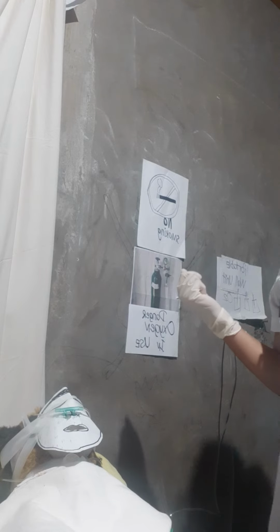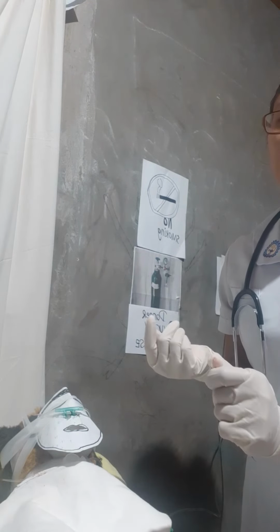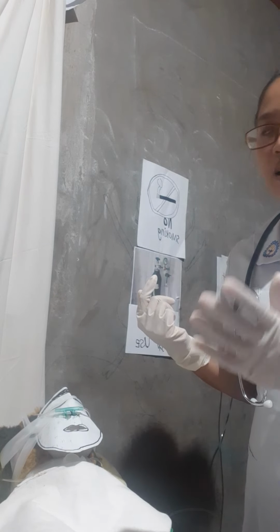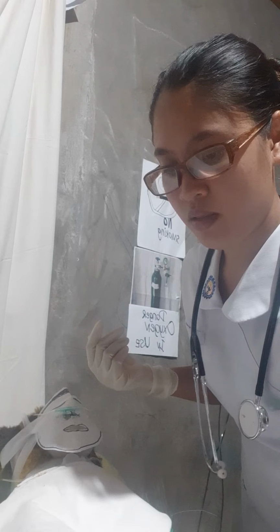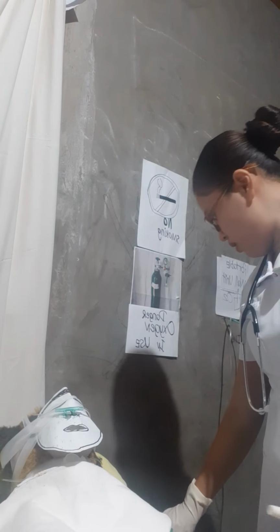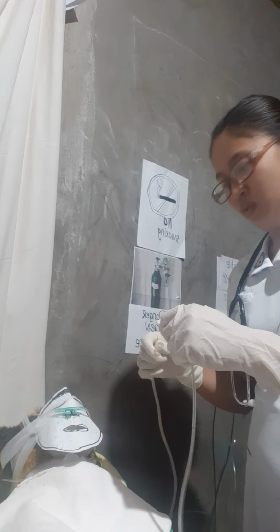Then for implementation, with the dominant hand with sterile gloves, pick up the sterile catheter, and with the non-dominant hand pick up the tubing. Then we need to connect it.